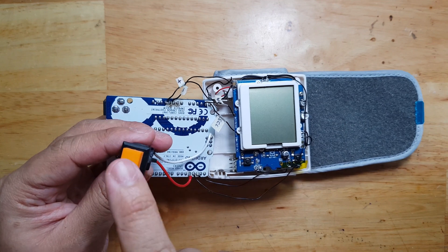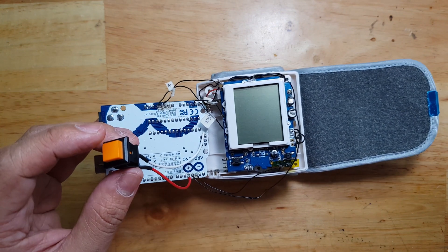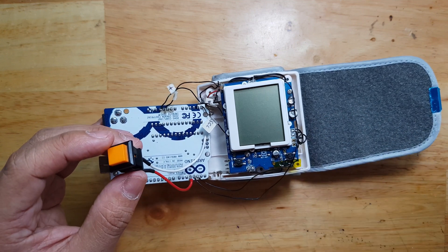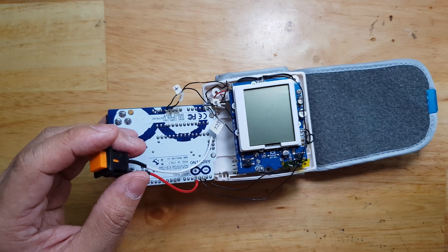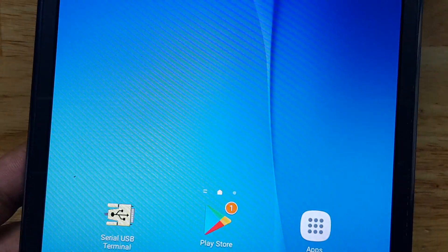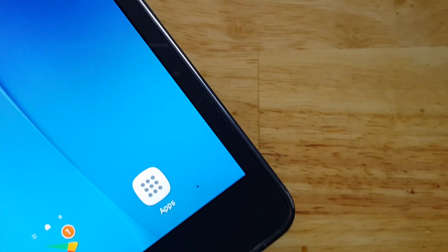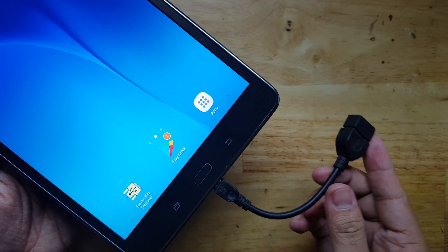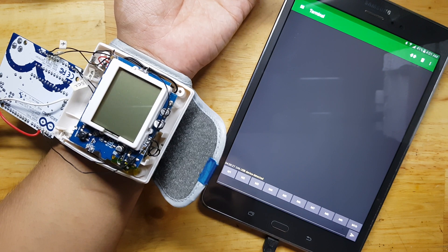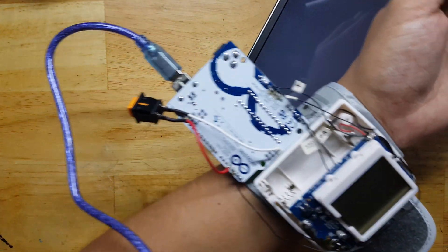I also added a button connected to digital pin 4, which will indicate when to start the operation — when the Arduino starts the blood pressure monitor, gets the reading, and sends it through the serial monitor via UART. For the demonstration, I will use a tablet with an application called Serial USB Terminal. I hooked up a USB OTG cable to connect to the Arduino so we can see the serial output. The USB device is now detected.